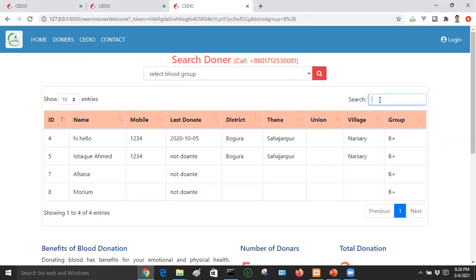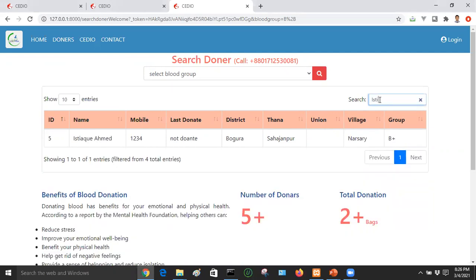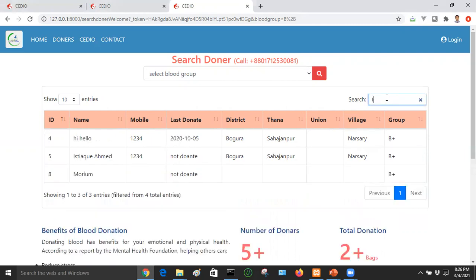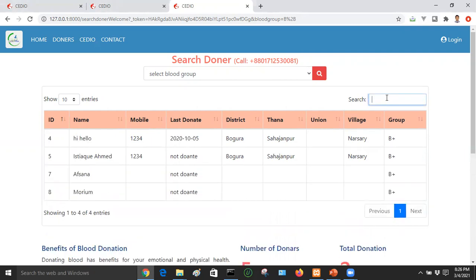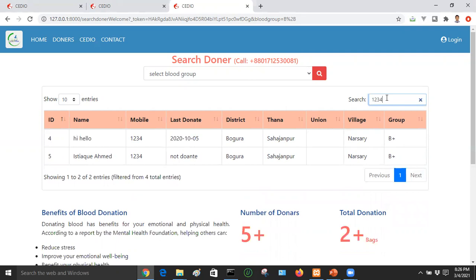If you have a name, you can write it in the search field. If you have a mobile number, you can write it as well — simply enter the mobile number. This is the dummy data that we have added.